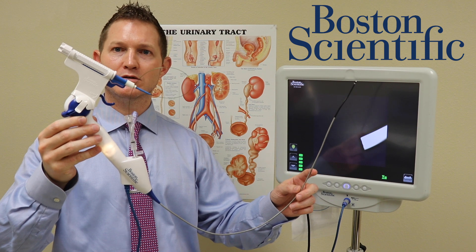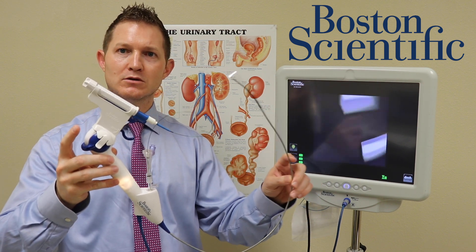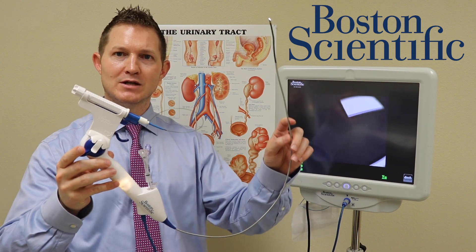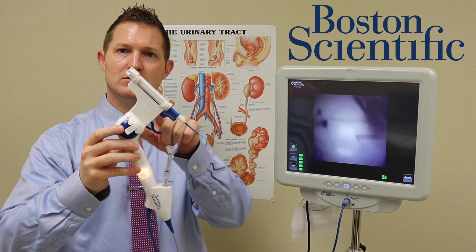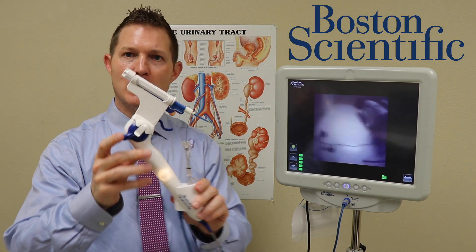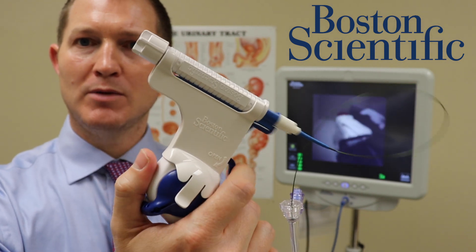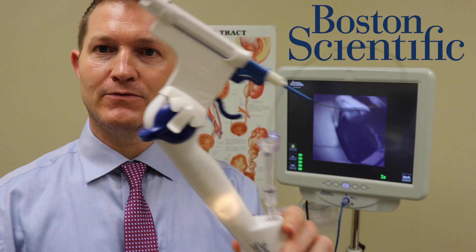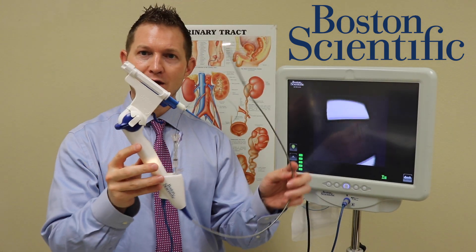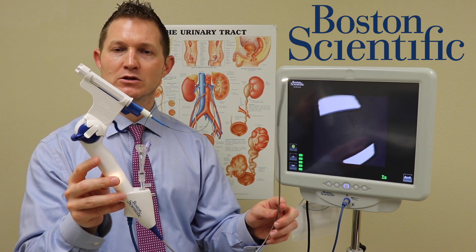All of this that you see here — the scope itself, all the way around to the extension that allows us to navigate all the way up into your kidney. There is also a piece here called the Empower device, which allows your surgeon to manipulate the basket by themselves. All of this is disposable — it will never have touched another patient and will always be specific only to you.